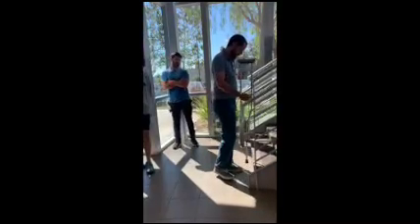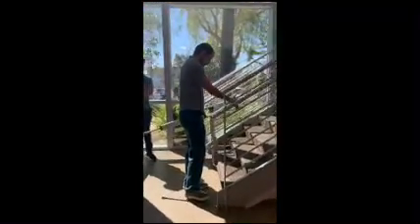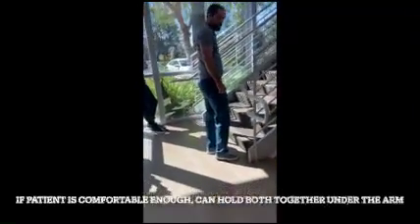Yeah, so we're going to get up to the stairs. What do I do with my second crutch? Turn it over to the other side. How do I hold it? So you can do it this way. If your patient is comfortable, you have two options. You have this, or you have this. So usually if your patient has smaller hands, you'll need to do the T position here. If they have large enough hands and they feel comfortable doing it this way, then this is fine.